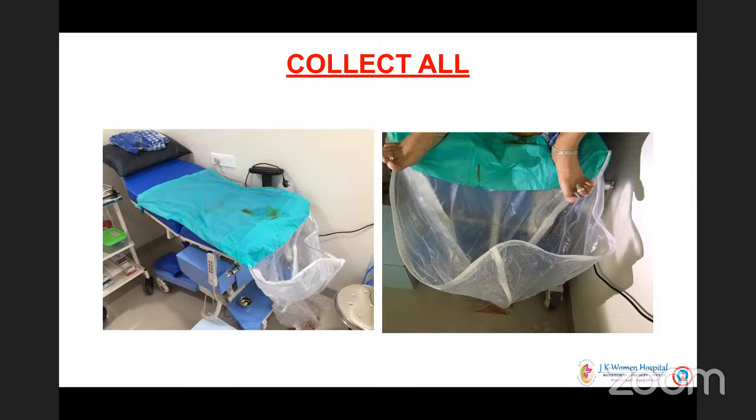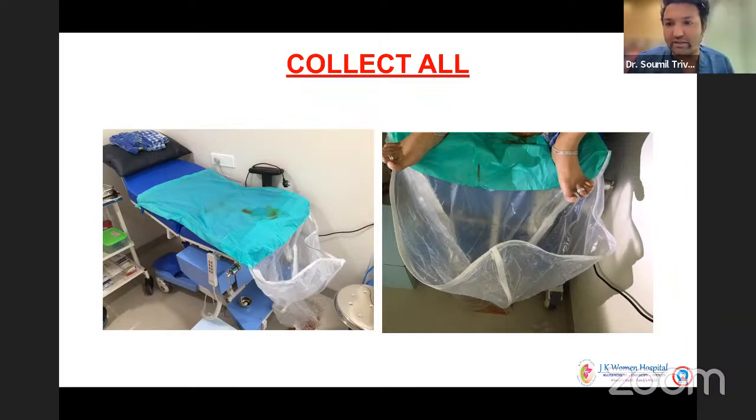Yes, we are talking about operative hysteroscopy, where we are dealing with pathology. This is not for the diagnostic or a small one. No, for diagnostic, we are not bothered.